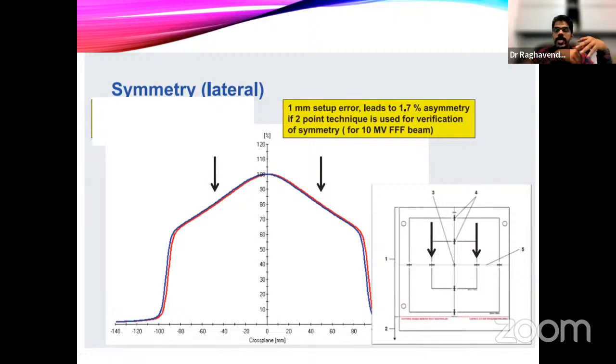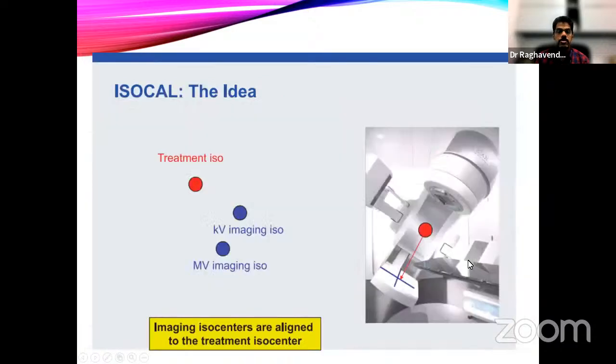You understand why we came out of all those different protocols for this one, triple F. This is one of the reasons. A small offset of this will give you huge uncertainty in terms of asymmetry, and if you ask the engineer to correct this, very difficult, because there is no steering coil which is responsible for the small jerks which we are seeing because of our measurement issues.